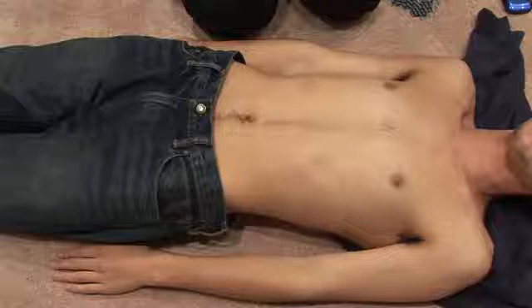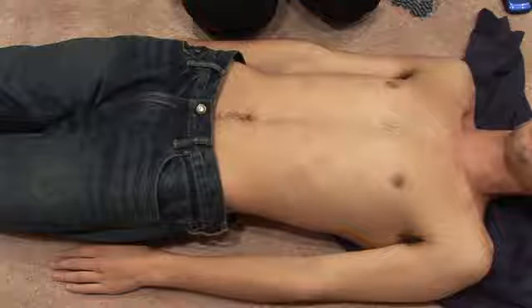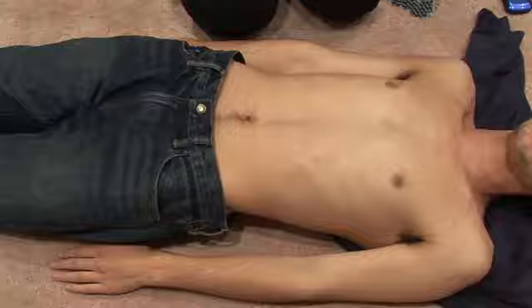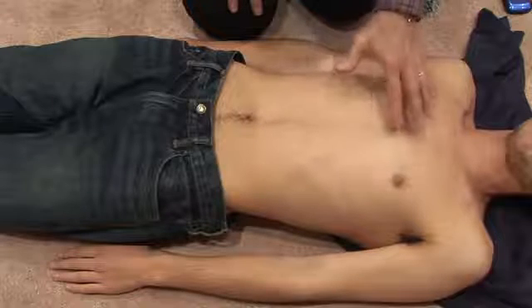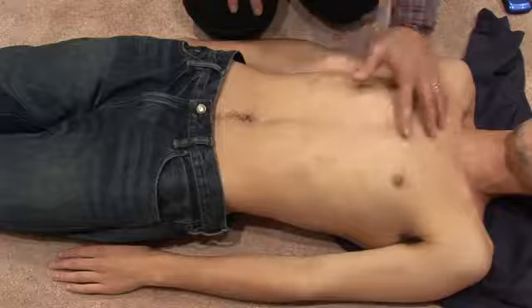Hey, this is Dr. Nick from the ECG Academy, and we're going to go over the anatomy of the chest, because in order to put the ECG electrodes in the proper place, you have to be familiar with the anatomy. I've seen a lot of people put the ECG leads in the wrong spot, and then it makes the ECG look abnormal when it isn't. So let's go over the anatomy of the chest.